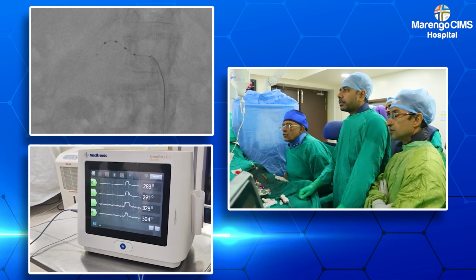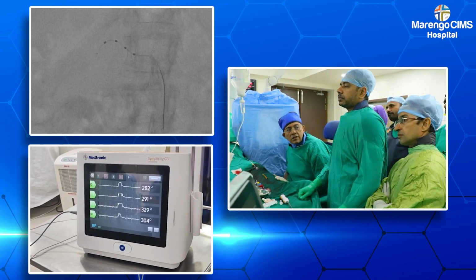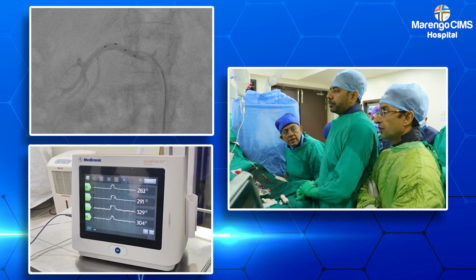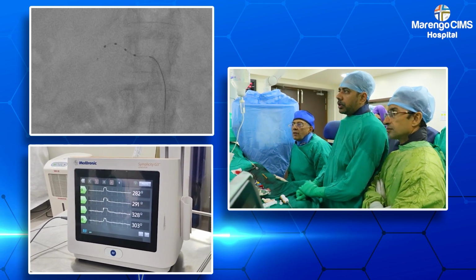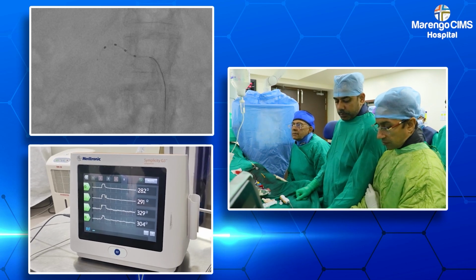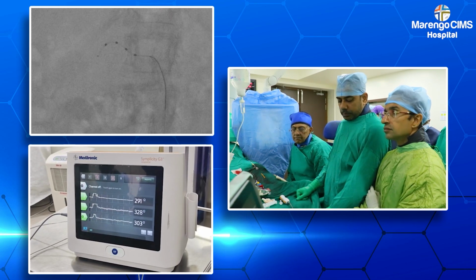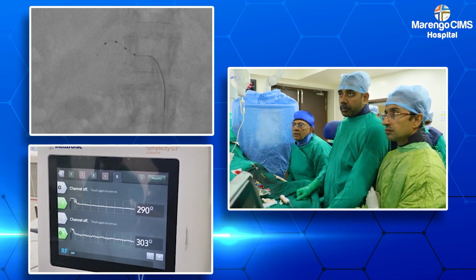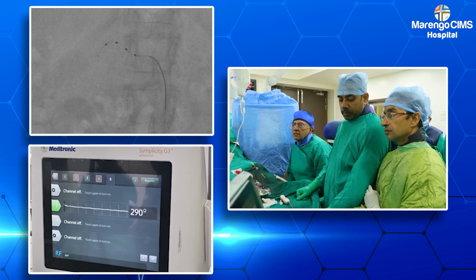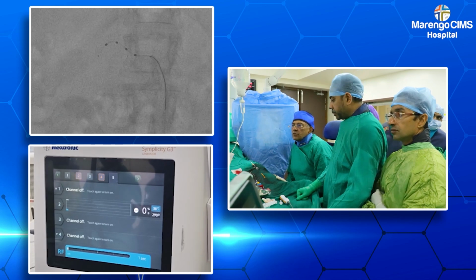So we will switch off the first, third and fourth electrode, right, Dr. Tejas and Vipul? Yes. Okay. So we will do a 1 minute run to cover that distal segment of renal artery before bifurcation. So we'll go ahead and switch off all the other 3 channels and do a selective run. So we have started.